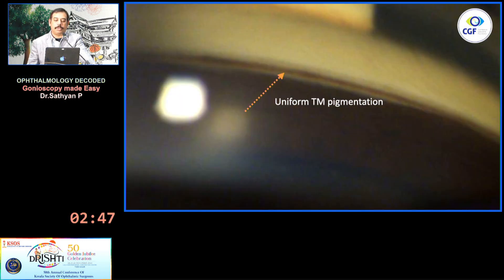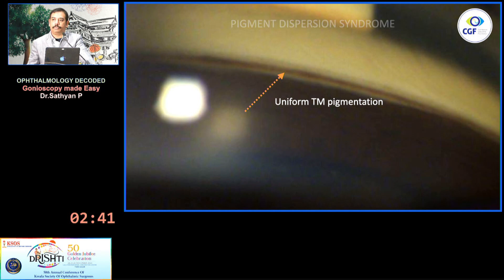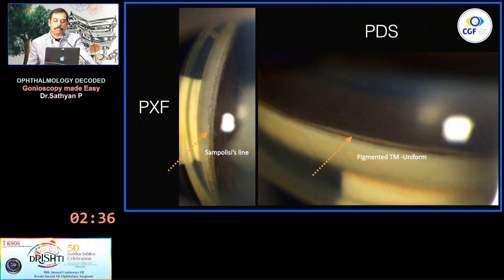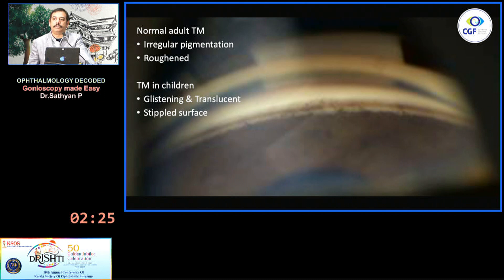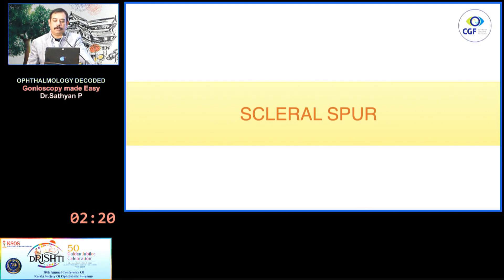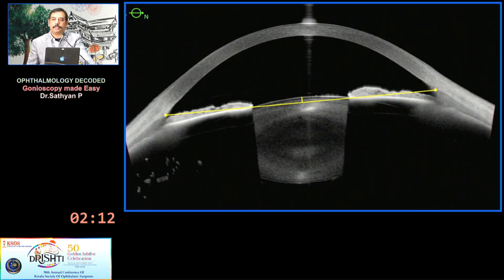Then you have the trabecular meshwork. Uniform 360-degree pigmentation on the trabecular meshwork is very typical of pigment dispersion syndrome. You should not confuse the Sampaolesi's line with the pigmented trabecular meshwork. Usually the pigmented trabecular meshwork has irregular pigmentation and is rough. In children it is very lightly pigmented or glistening. Then comes the scleral spur — this is a very wide band and a very critical structure in the anterior chamber angle, especially when doing OCT.